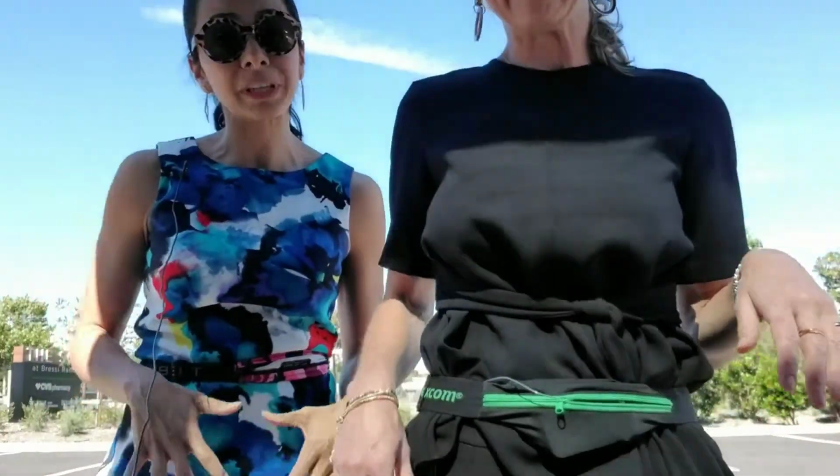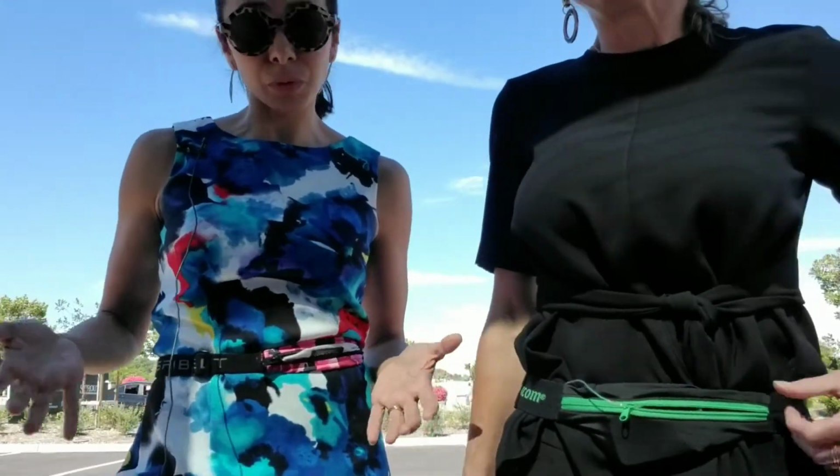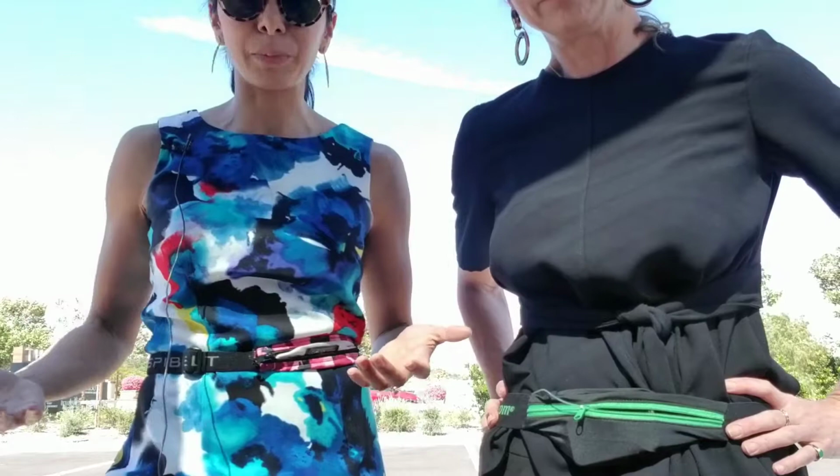Another benefit to having tubing is the flexibility to change to different infusion sets, because there are three different types of infusion sets on the market. Some are flexible Teflon cannulas, others have a metal tip, and depending on your time with diabetes and any scar tissue buildup that you have, or even just your comfort level, you can switch out to the different types. Whatever infusion set you first got when you started on the pump, you do not have to stick with if you find it is not working for you and it is not giving you the best blood sugars.